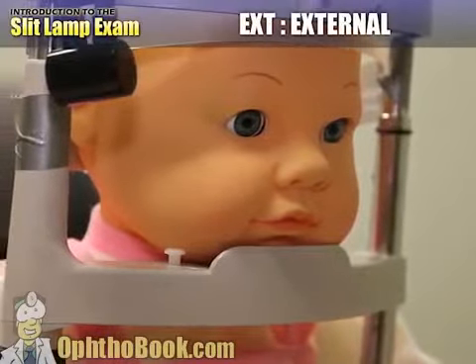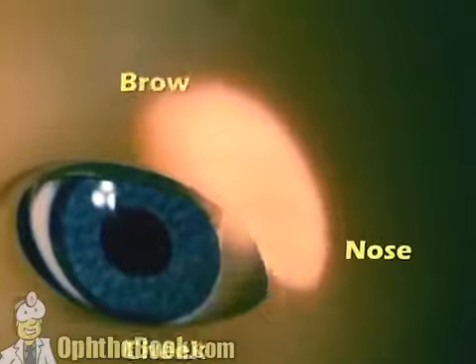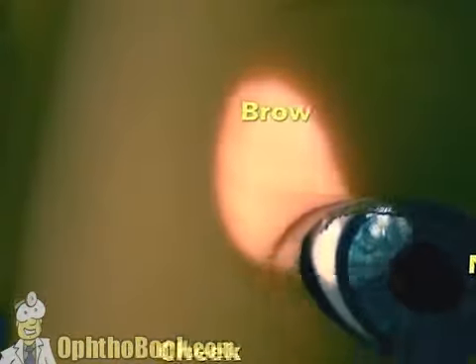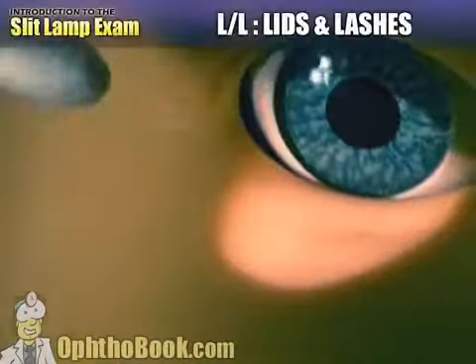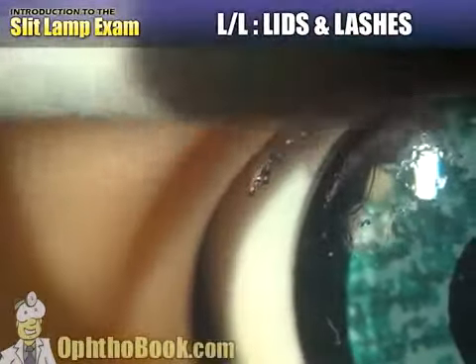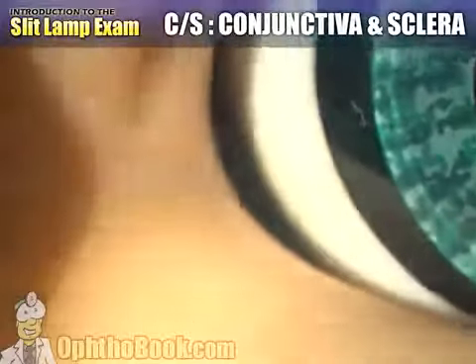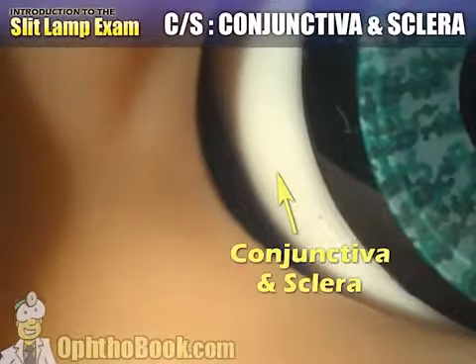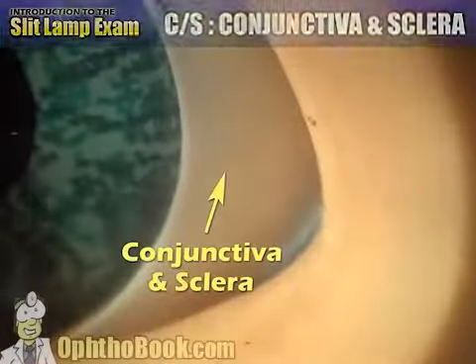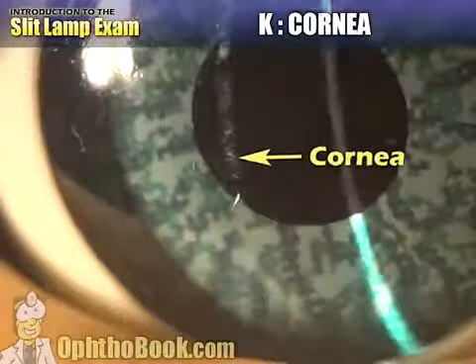So we're going to move on to a different model, something that's a little bit more anatomically correct. And we always start with the external eye disease, and we look at the cheek, we look at the nose, we look at the brow, things around the eye that might cause ocular problems or be related. Moving on to our lids and lashes, you always look at the lid margin, and you look at your lash line, of course, as well. Moving on to the conjunctiva and sclera, the white part of the eye, white and quiet here. We'll go over this in a little bit more detail in a bit. And then we move on to, of course, the cornea.